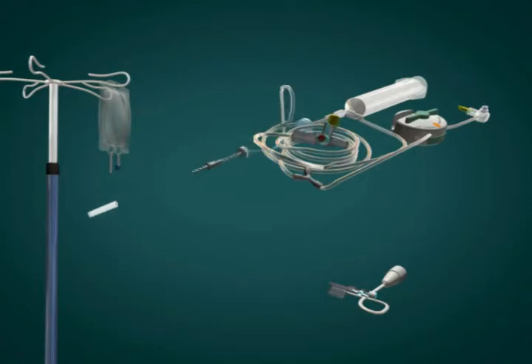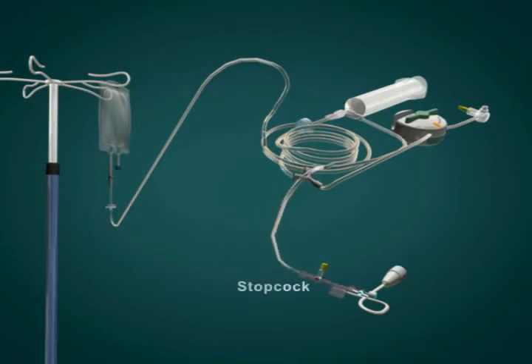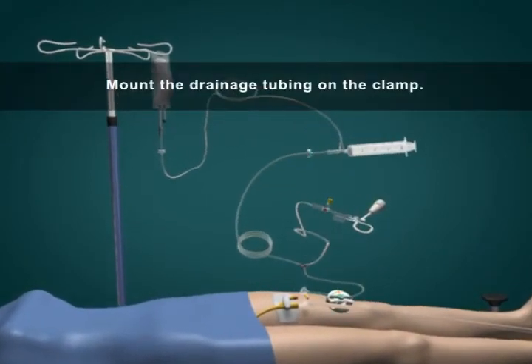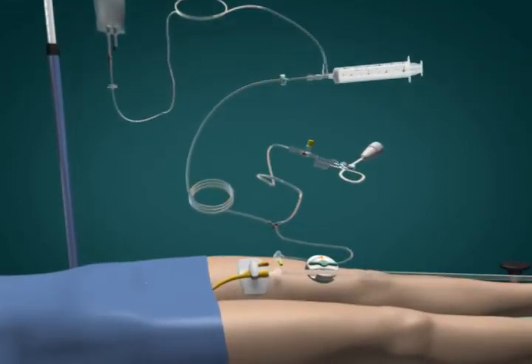Remove the protective cap from the saline spike and insert the spike into the saline bag. Connect the transducer to the end of the tubing labeled 'transducer' using the provided stopcock as needed, depending on the transducer assembly available. Mount the drainage tubing on the clamp. Decide whether the pressure transducer will be mounted on the pole or the patient.